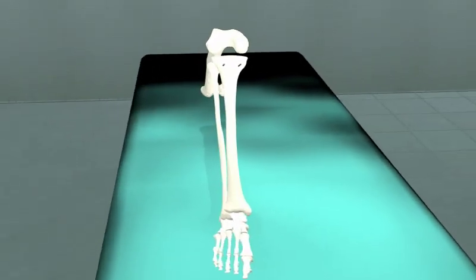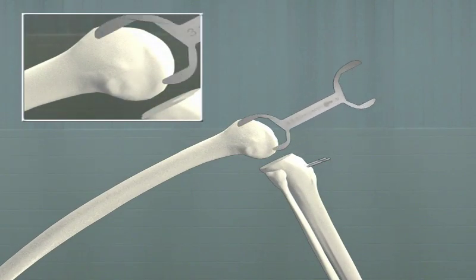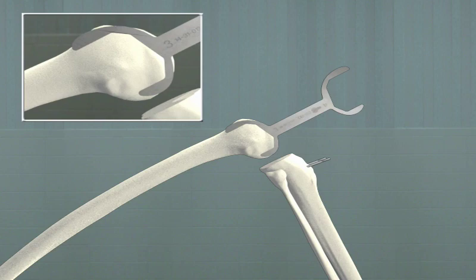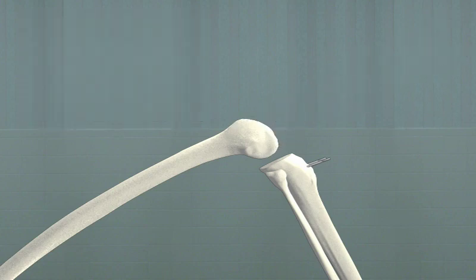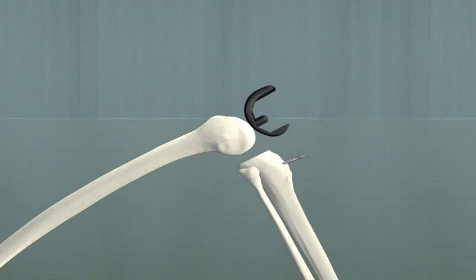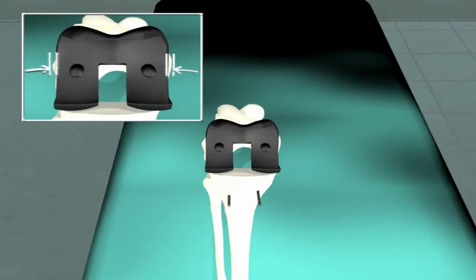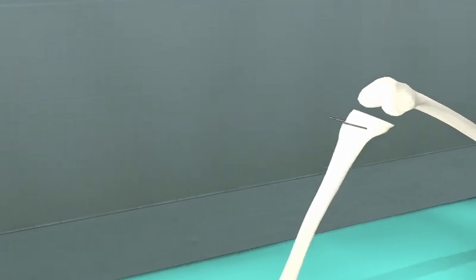The femoral templates are used to assess the actual dimension of the femoral resection guide. Note this size 3 template matches just about identically the size of the bony articulation of the femur. Taking the size 3 trial, in this case, it seems to be a superior fit over the size 4, which was too large. By reversing the size 3 trial and placing it on the anterior femur, we can use it as a guide medial laterally to be dimensionally correct.